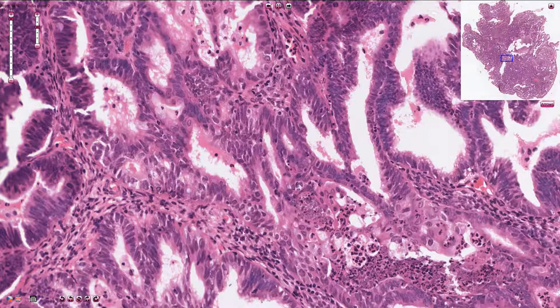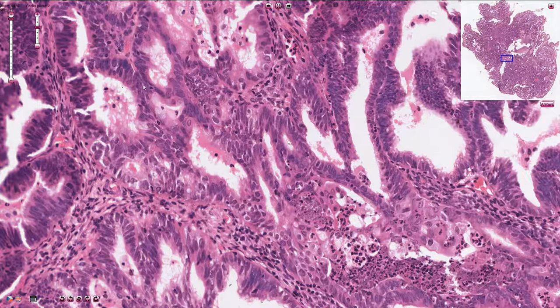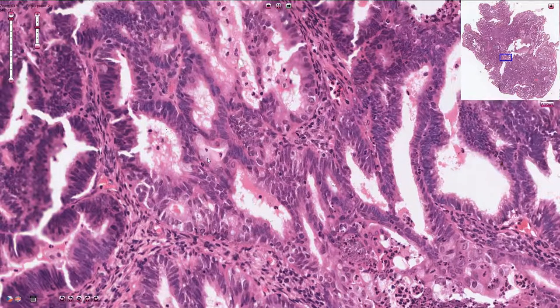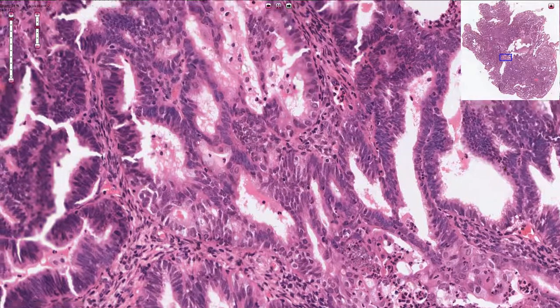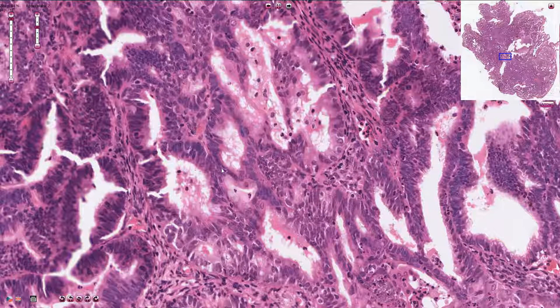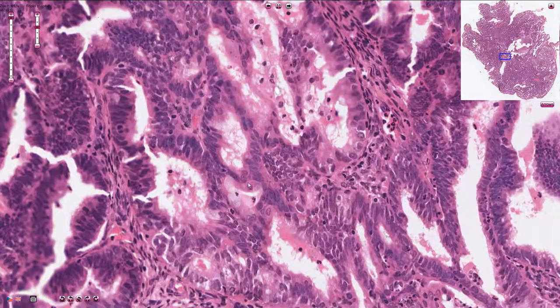Here we have an example of the stromal component, and next to the stromal component we can see cribriform formation and back-to-back glands, which is again typical for adenocarcinoma.